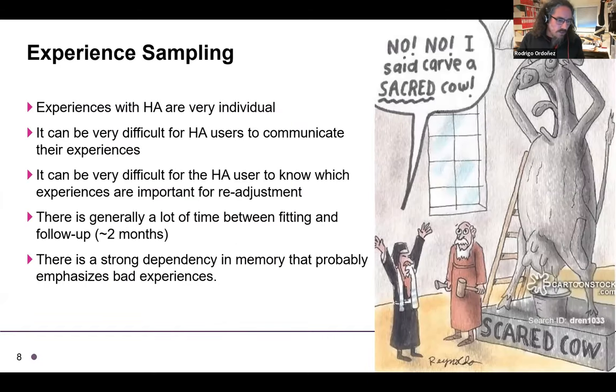So what is experience sampling? Experiences with hearing aids are very individual, as we've heard so far. It can be very difficult for hearing aid users to communicate their experiences, and to know which experiences are important for the readjustment process. So that's one of the issues for trying to assess experience in an ecological manner.